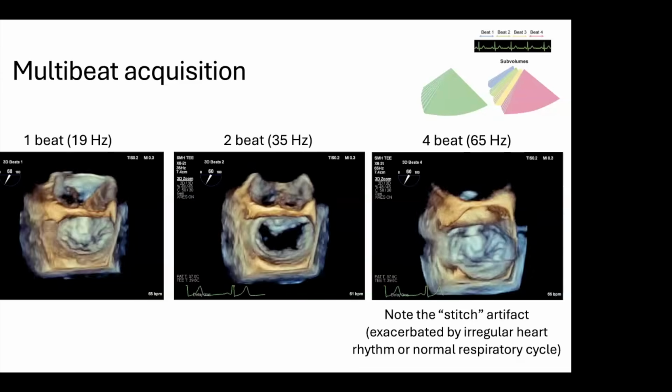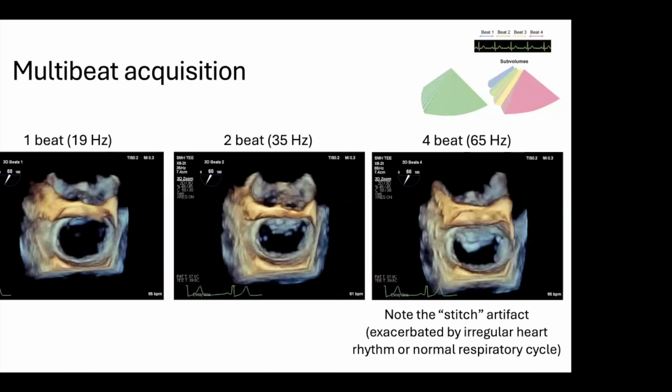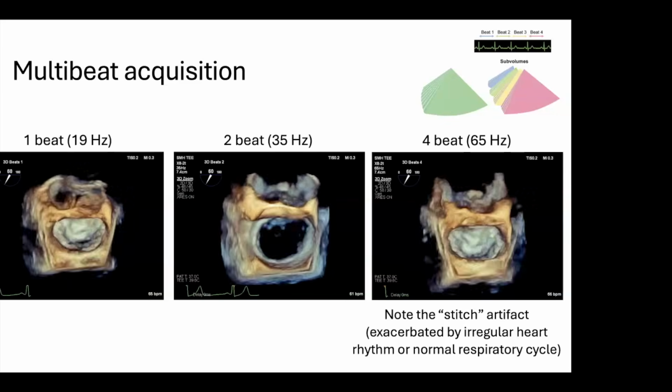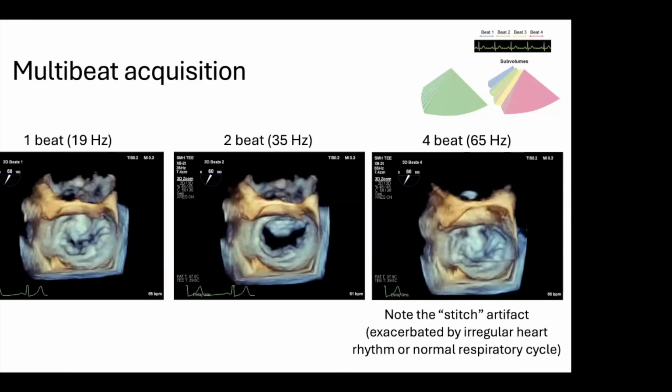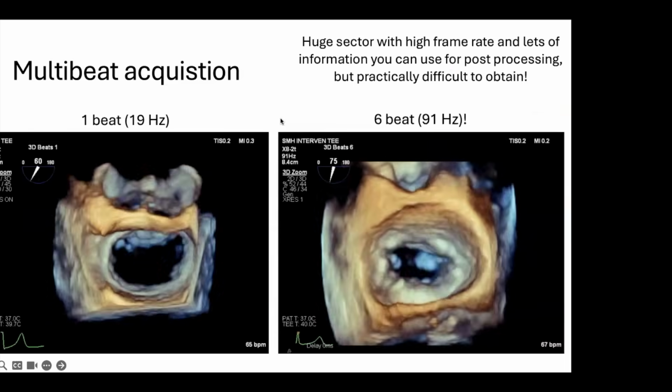So in the cath lab, what we'll often do if we want a high quality data set and the patient's intubated and sedated is we'll pause the lungs for a few seconds to acquire that image so that there's no movement, and then we have a good quality data set that we can then dissect, and then we let the patient breathe.